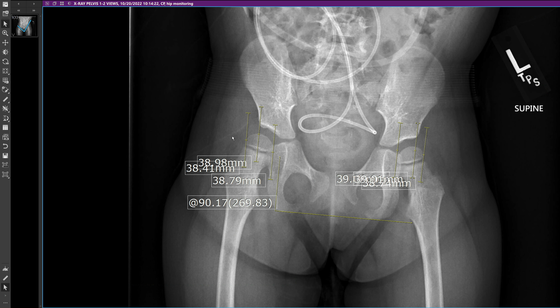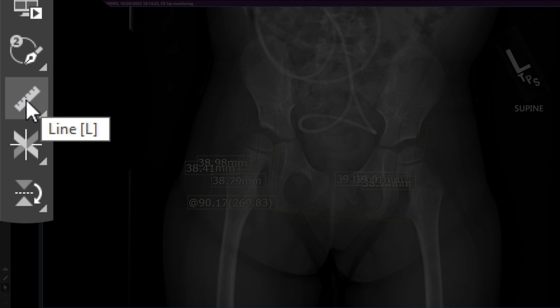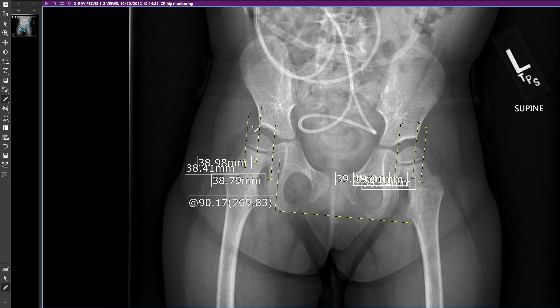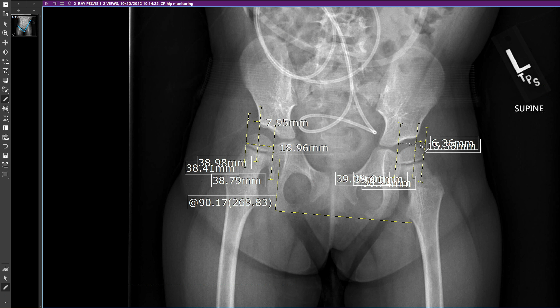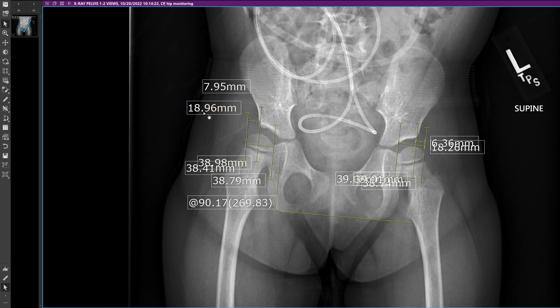Now we measure the various values and find out what the migration percentage is. We're measuring from the medial to lateral margin — essentially the diameter of the femoral head — compared to how much of the femoral head lies lateral to the lateral margin of the acetabular tectum. Our migration percentage will be 7.95 divided by 18.96 on the right, and 6.36 divided by 18.26 on the left.